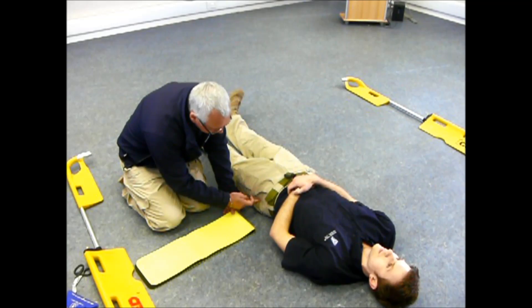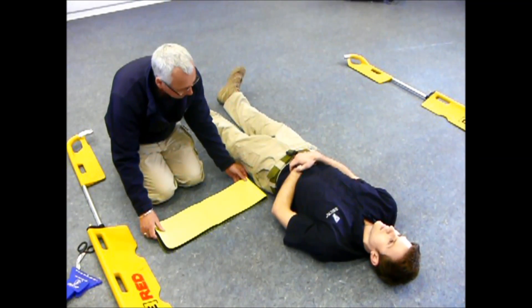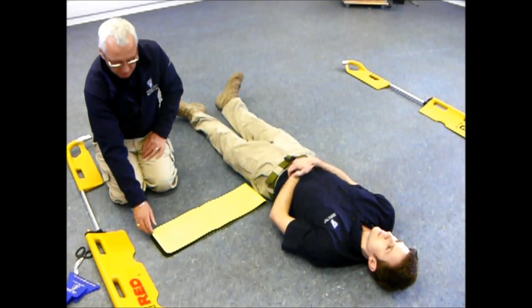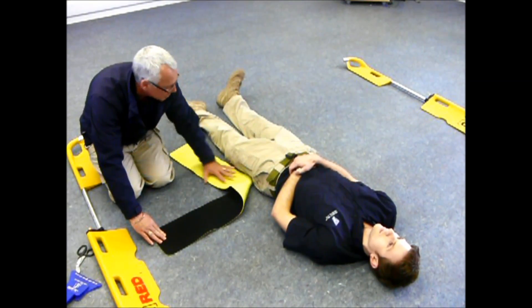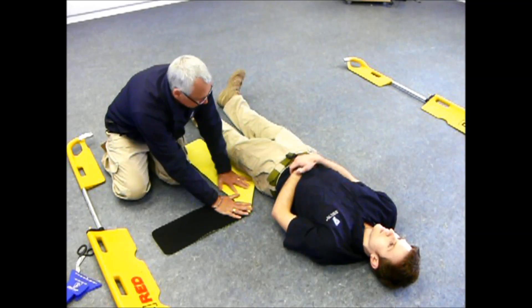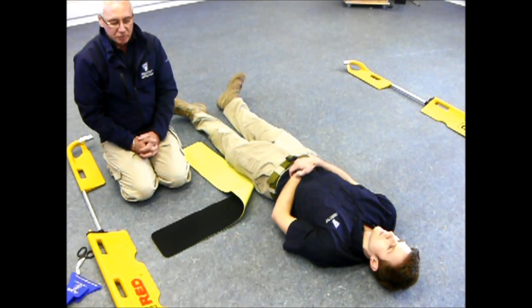Locate the patient's greater trochanter, which on this patient is here. Immediately lay the belt there, midline to the greater trochanter. What we have to do now is take the top part of the belt and unfold that down to the L-shape, down the patient's leg, making sure the midline is still in line with the greater trochanter. We can now put the scoop stretcher in place.